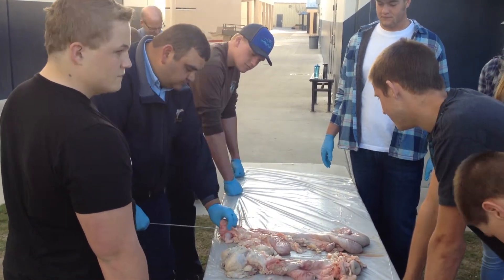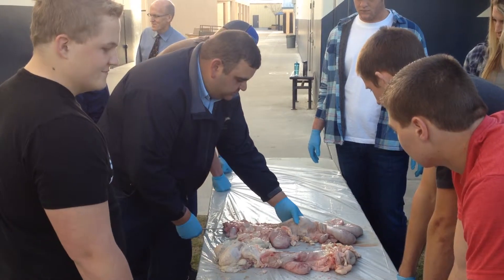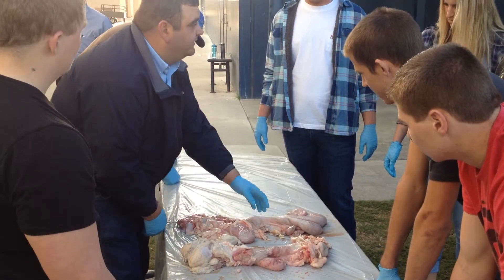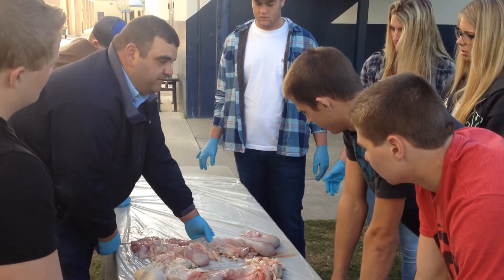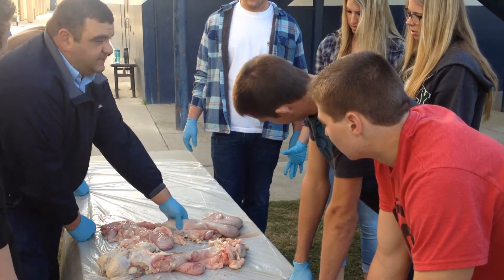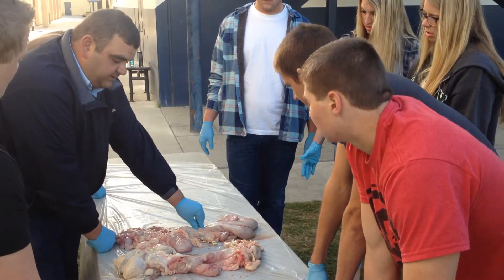Bad deal. Run this up at a 45-degree angle. Put your thumb out in front of the cervix. Stretch it out — you're not going to hurt the cow as long as you're not dumb about it. You can be fairly aggressive with it. When you get it kind of started through the cervix, see how I toggle it? I do that inside the cow. Toggle it a little bit — I'm already there. I'm in the body of the uterus.